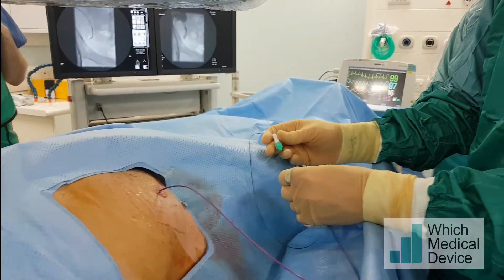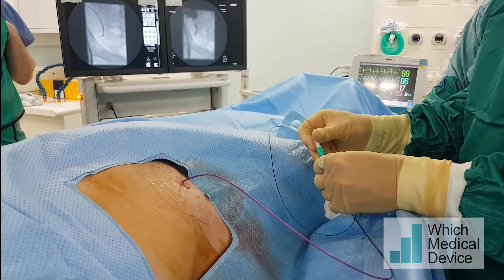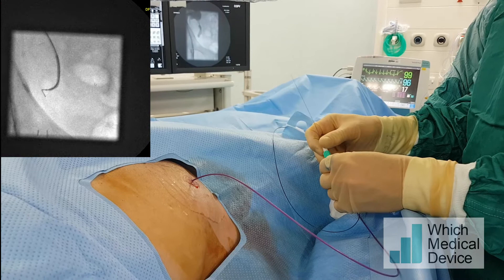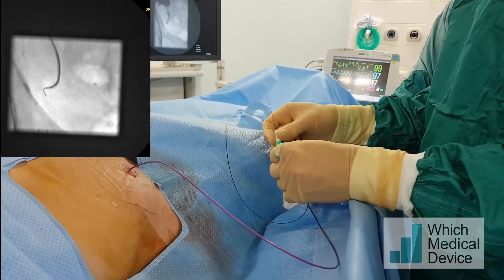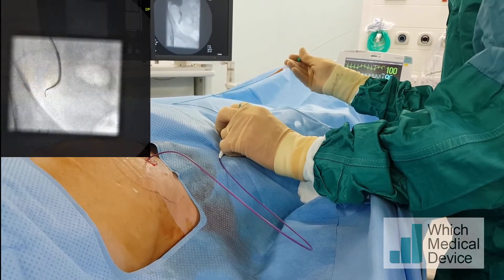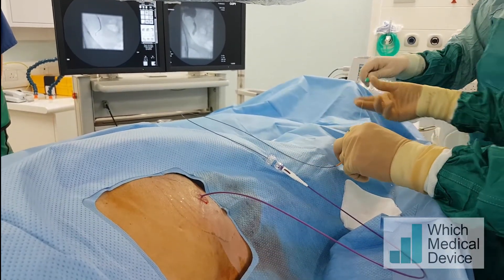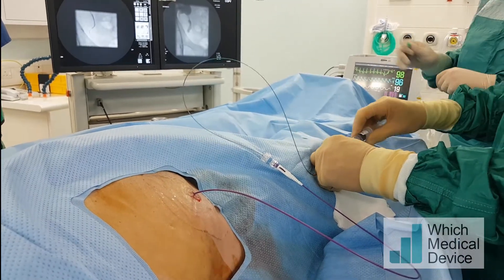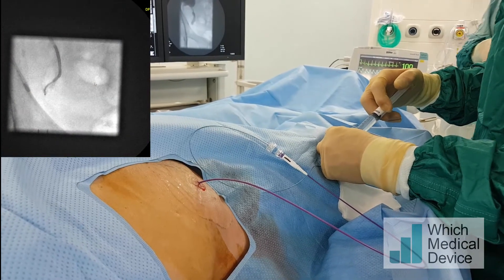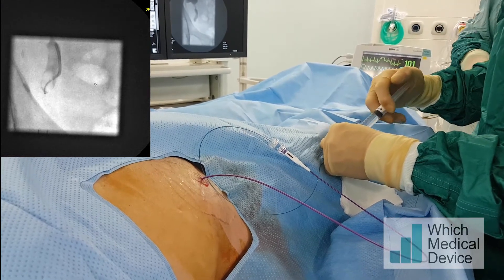Now I'm using the torque device, advancing the guide wire at the end of the micro catheter to see if we can get through this stricture. I'm going to try and advance the catheter into the end of the stricture. Let's take the wire out and put a bit of contrast in to see if we can see a way through. We're embedded right in the tip of that stricture.